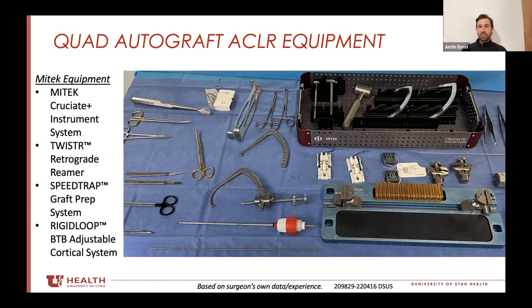That's why I don't do full thickness — I purposely try to take a cylindrical graft and shoot for a nine, always trying to be above eight and a half, getting between eight and a half and nine and a half. Doing that seems to have worked pretty reliably.